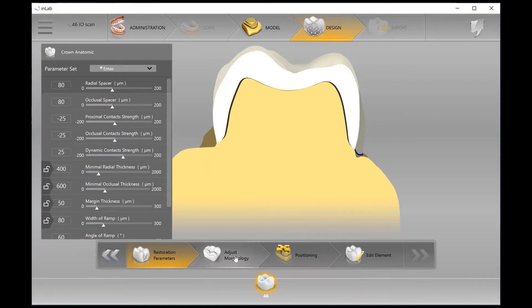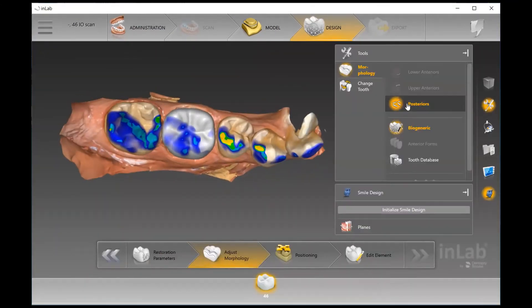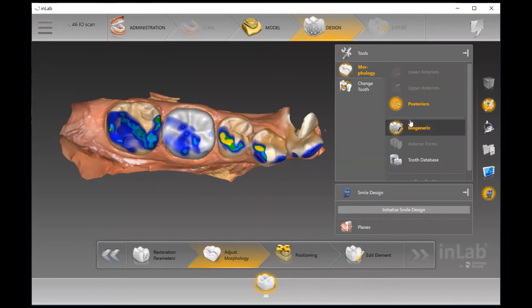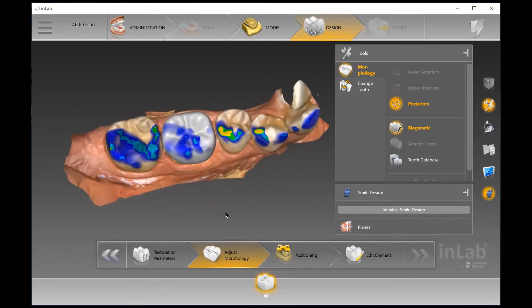The next step is Adjust Morphology. For a single crown, there's not much you would have to do here, but it tells the software that we're going to generate using Biogeneric. We have a large tooth library to choose from in terms of anatomy and morphology of the tooth shape. Biogeneric is quite unique to the InLab and CEREC system — it lets you get the most specific design for your patient based on what's in their mouth, what they're articulating against, and what's adjacent to it.